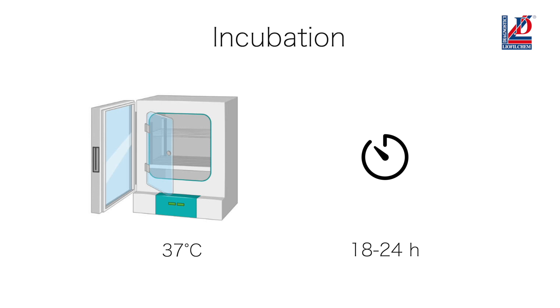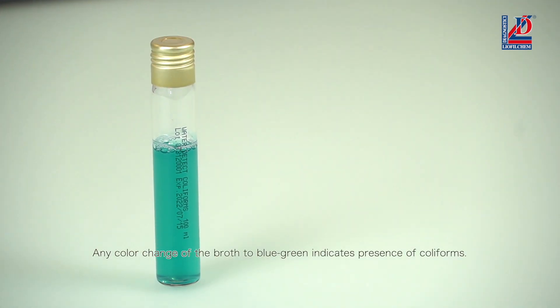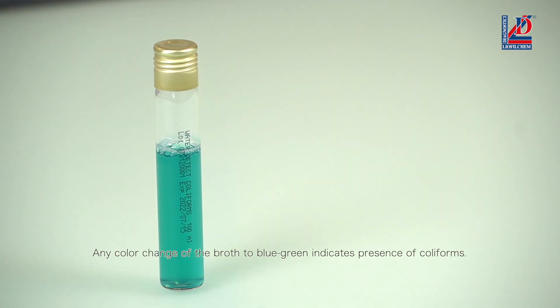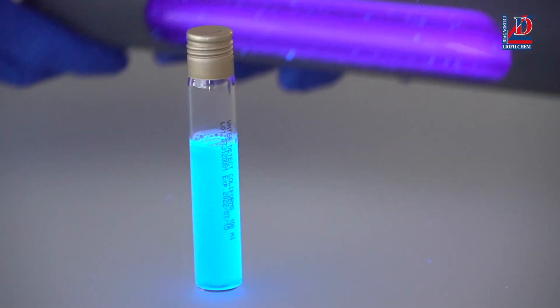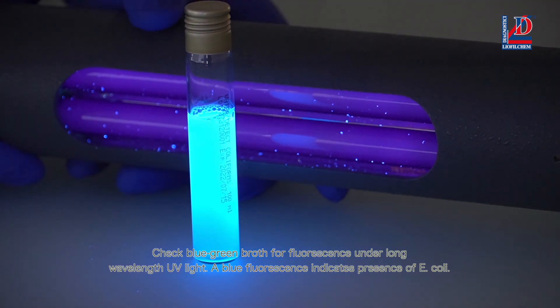Any color change of the broth to blue-green indicates presence of coliforms. Check the blue-green broth for fluorescence under long wavelength UV light.